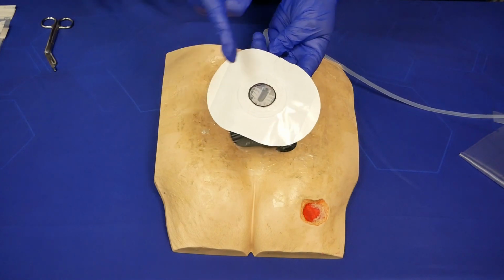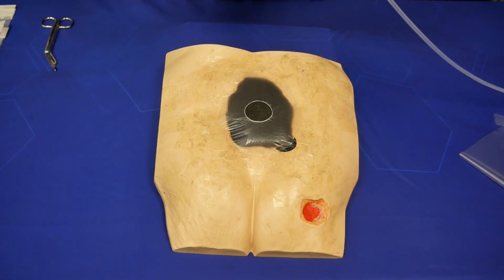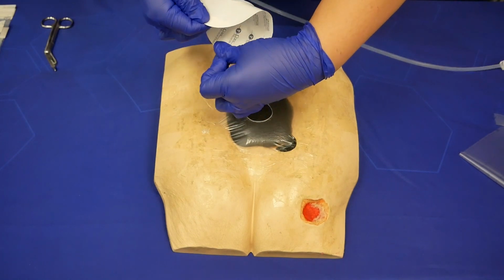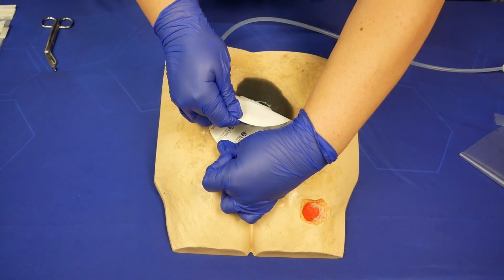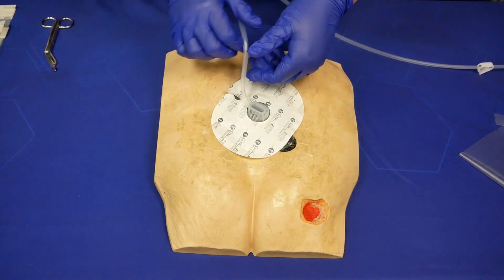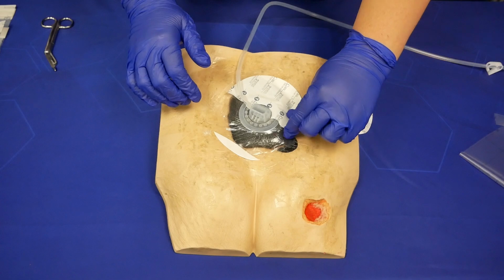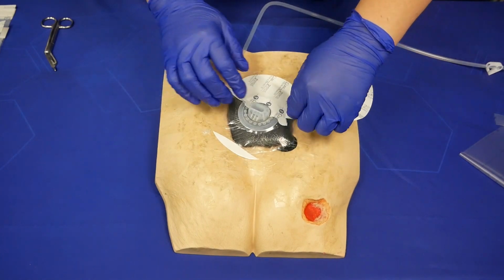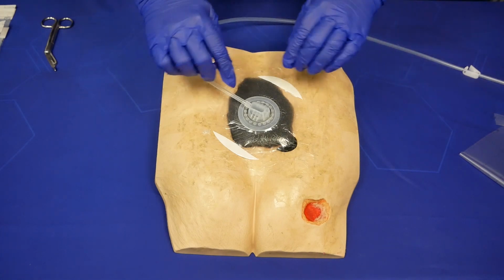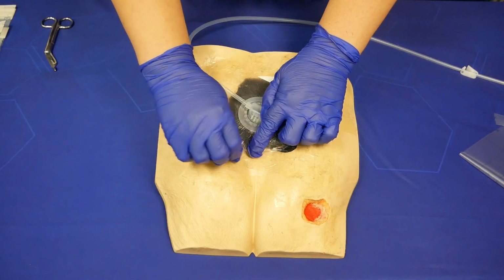The port pad has these wings, little handles on either side that you can use to help you apply this. Now I like to hold it like this, that way I can watch as I lay that down. And then we use our scalloped edges to peel away the top layer. And then the bottom handles flip out from underneath.